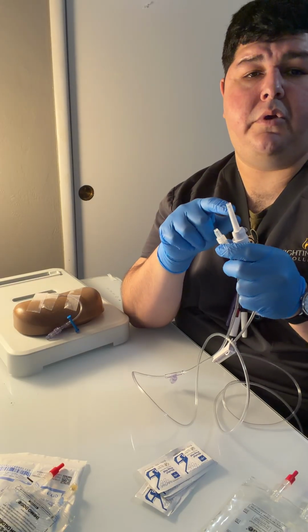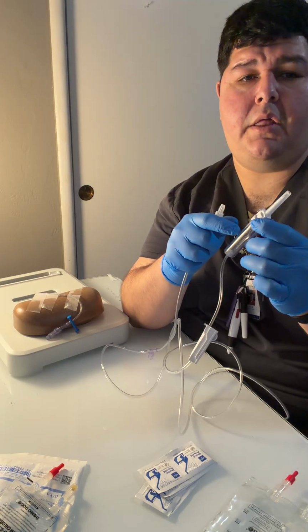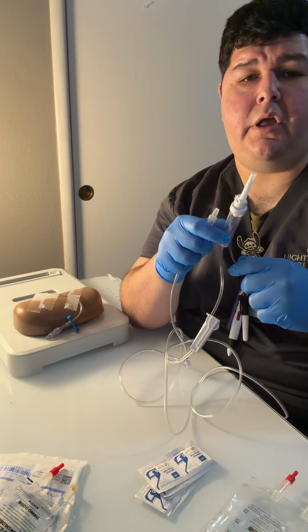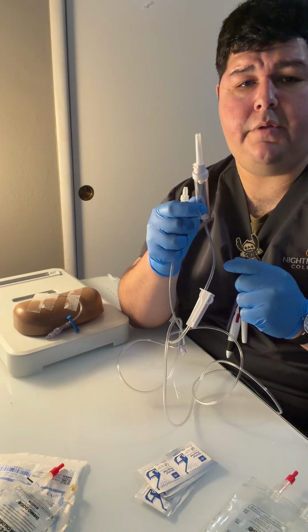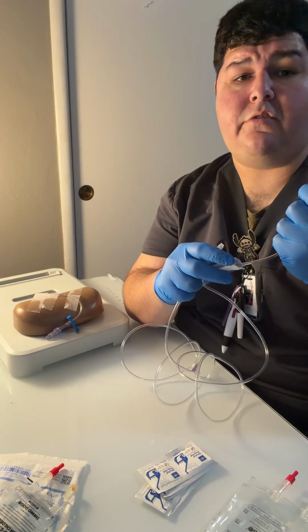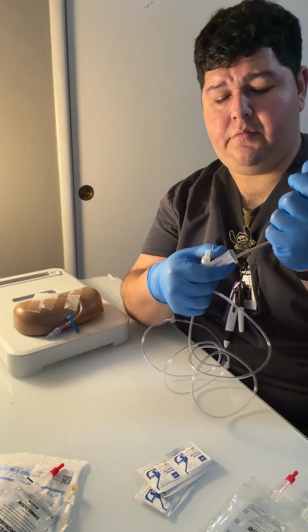This is the part that we would introduce into the bag. And then we have the drip chamber, and this would help prevent the air from entering into our tube, as well as it allows us to visualize our flow rate. Down here we have our roller clamp. This allows us to adjust the flow rate. So we're going to start with it in the position off.